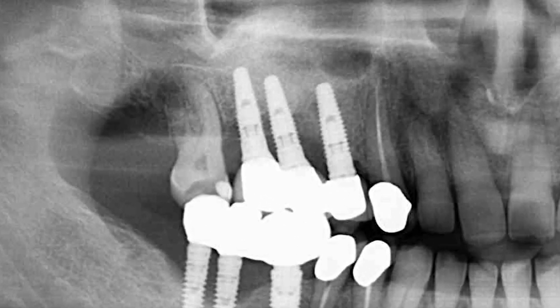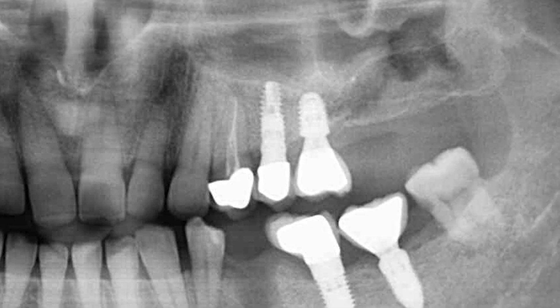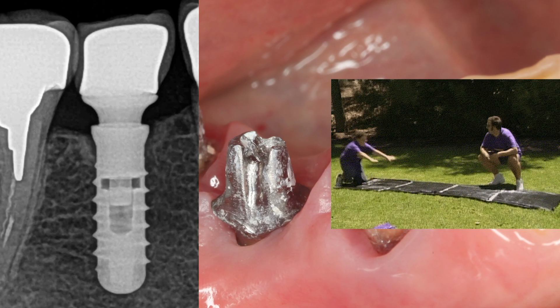Next, we analyze the radiograph, on which it is important to determine the type of connection between the implant and the abutment, and make sure that the fixation is screw-based and not monolithic, or that the abutment is held by friction.